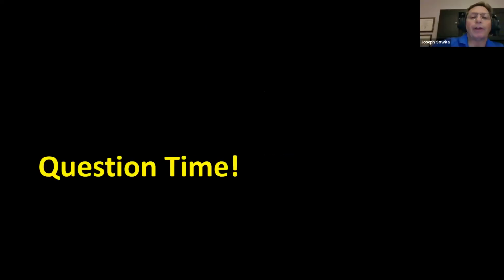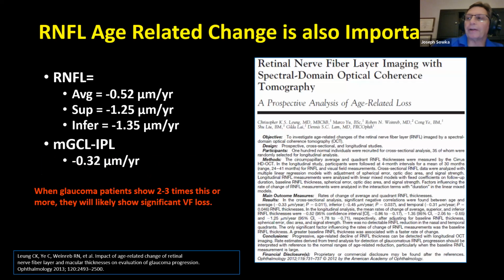Mike, there's a really good question in here that just came in. How long after initiating or changing therapy due to progression do you consider further progression to be caused by pre-therapeutic change damage? That's a good question because that's a really hard one to answer. After initiating therapy, change from pre-progression to current, I don't know that we can decipher that at any point in time.